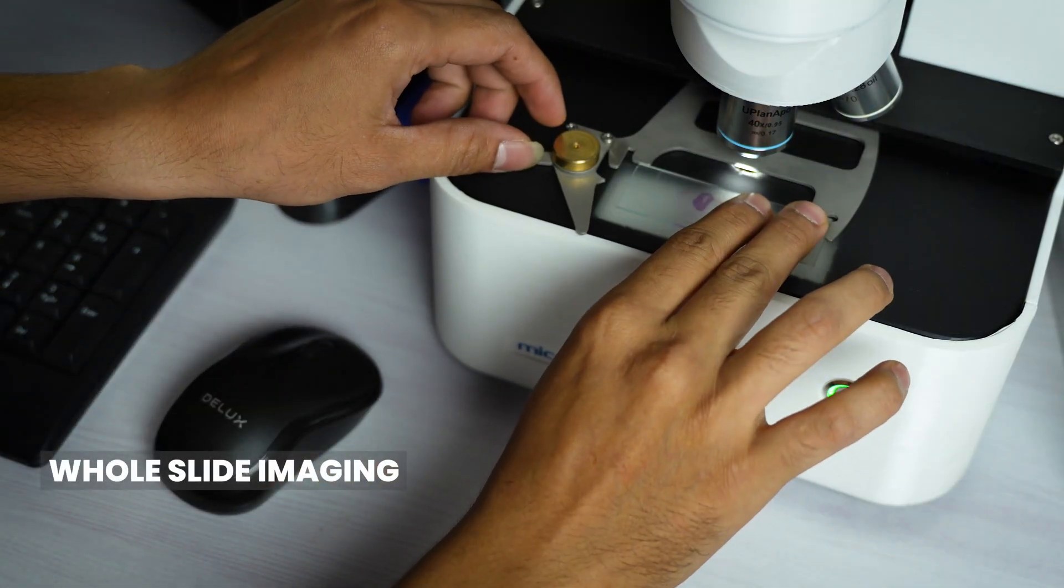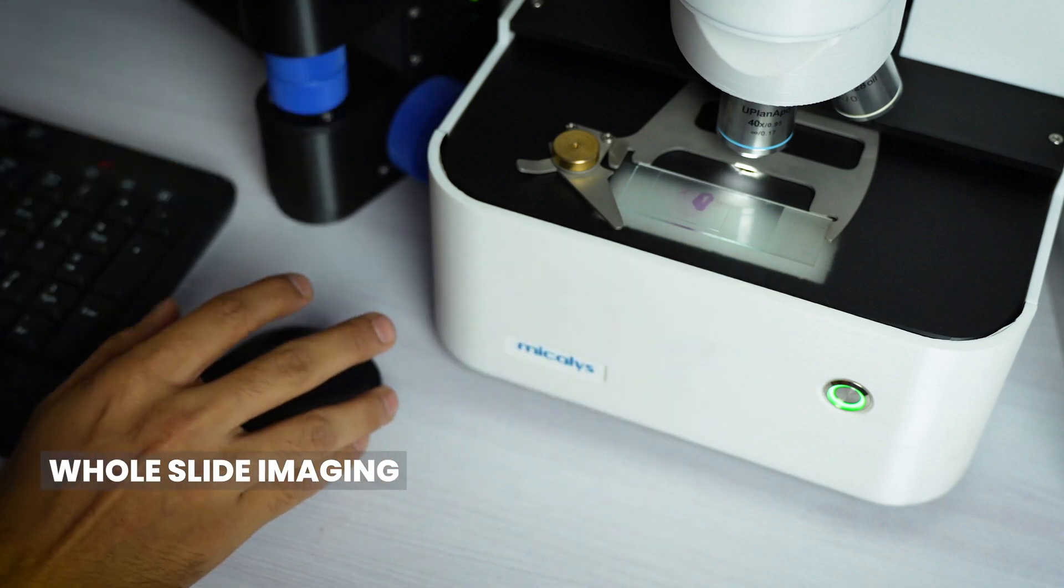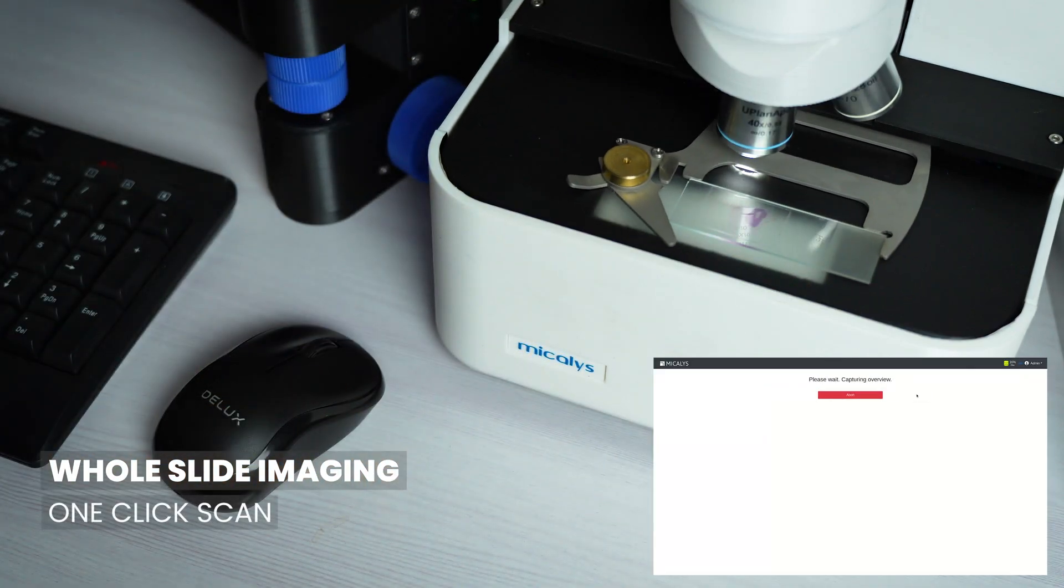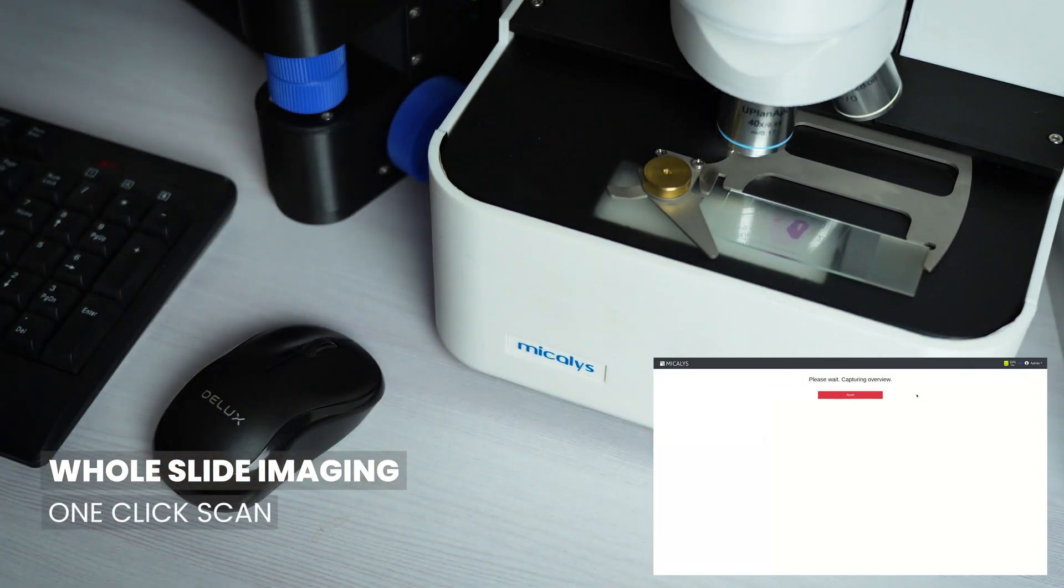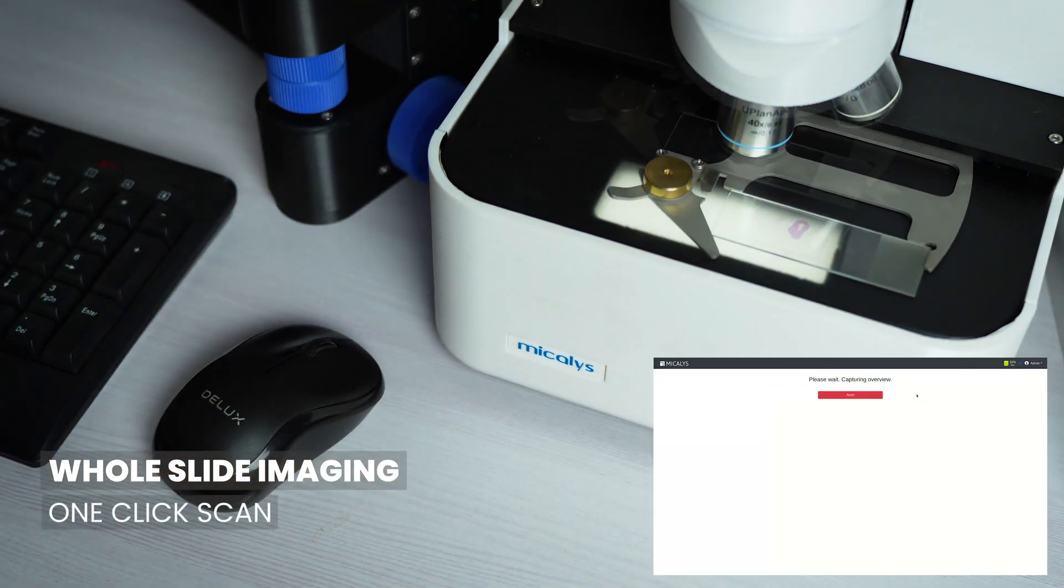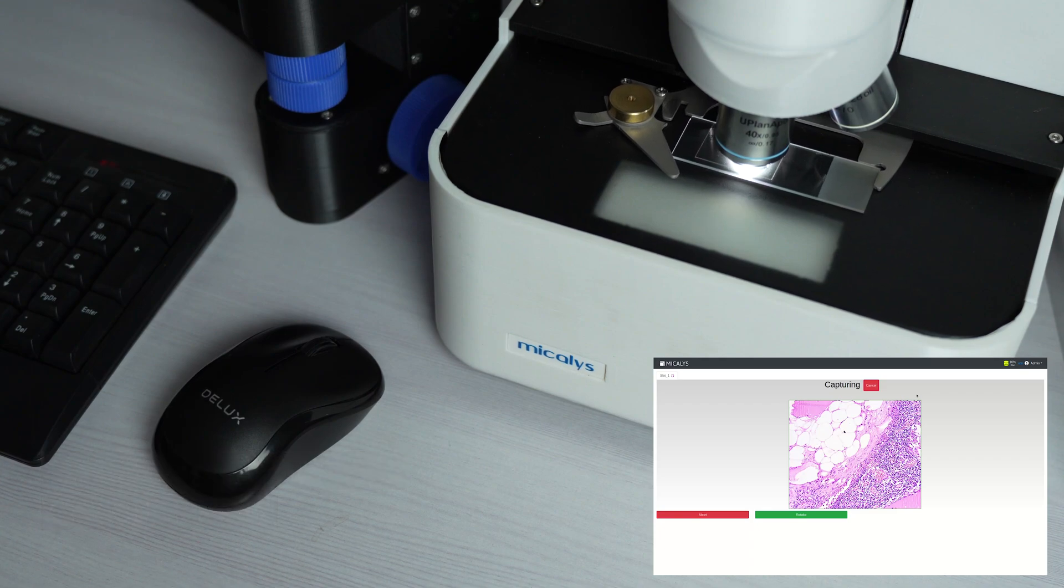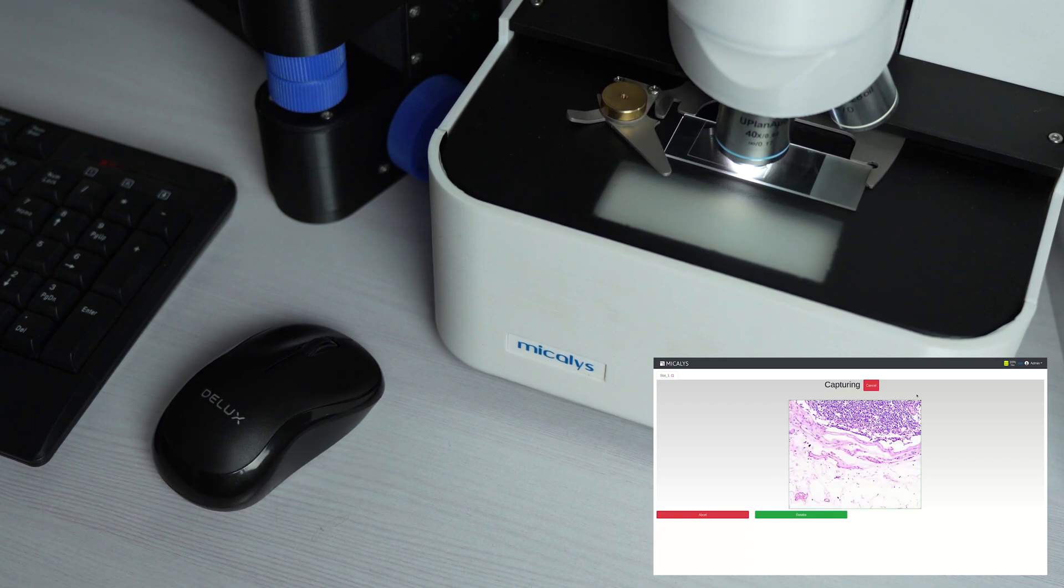Load the slide and with just a single click, our advanced AI based sample area selector will precisely mark the area and the system will scan the entire slide for you.